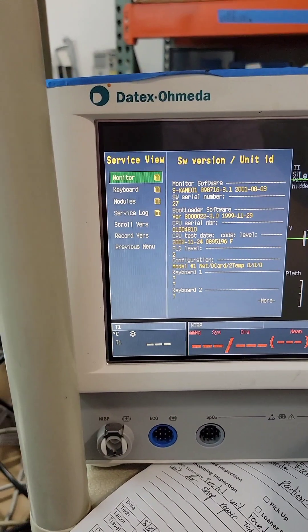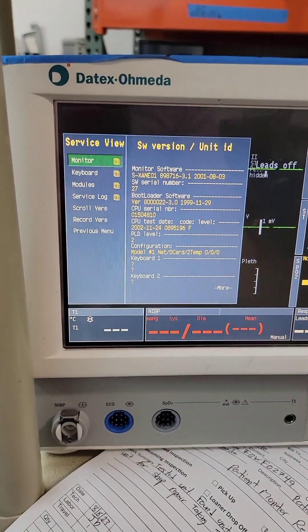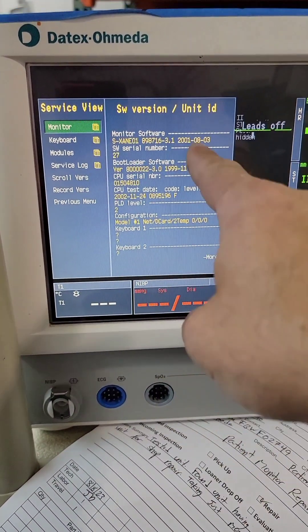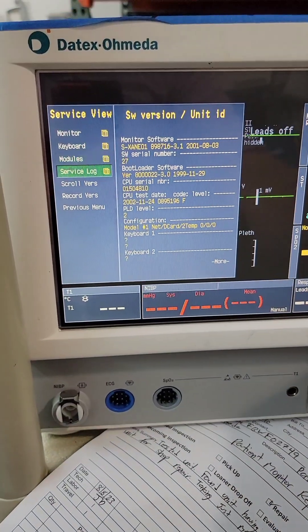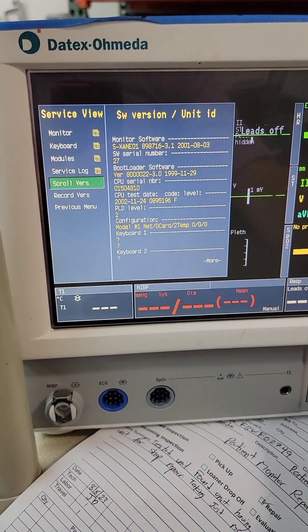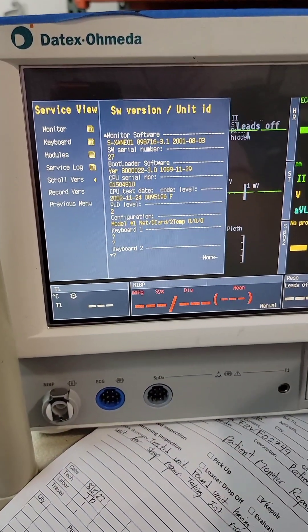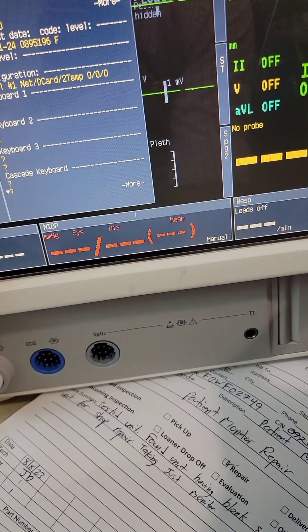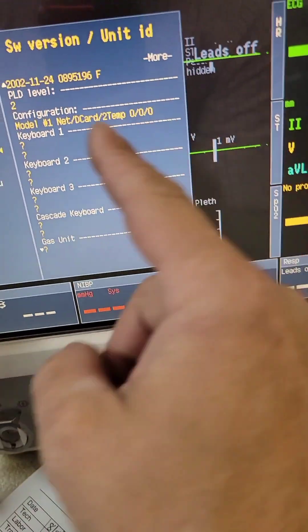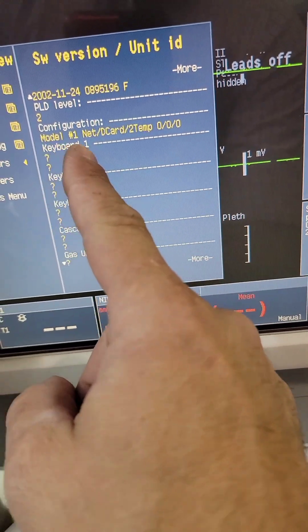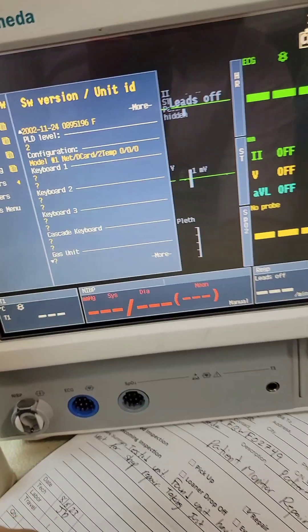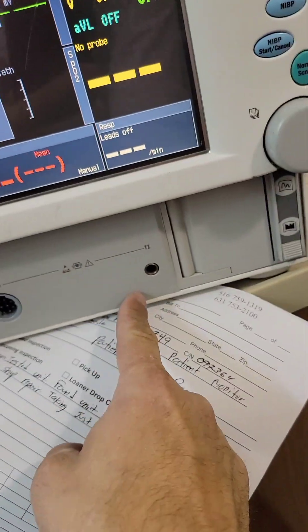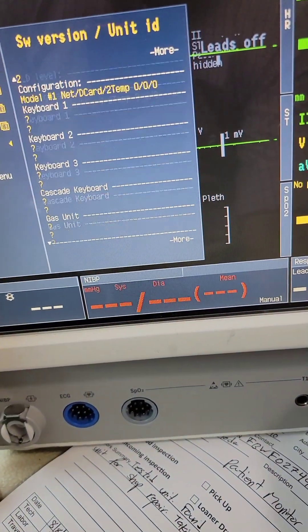Now from here, this is the first thing that pops up — monitor, software, and so on. It's what we want to scroll through. Go down to Scroll Version, click it, and now you can scroll. This is the configuration that's currently set — doesn't mean it's correct. In fact, it shows two temp, but I have one temp. This is not correct. We will fix this.